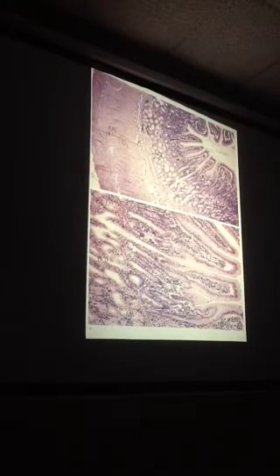And then if you're really good and your eyes are sharp this morning, you can start to see these little bubbles, just a little bit in the duodenum. Very important cell or tissue, goblet cells.